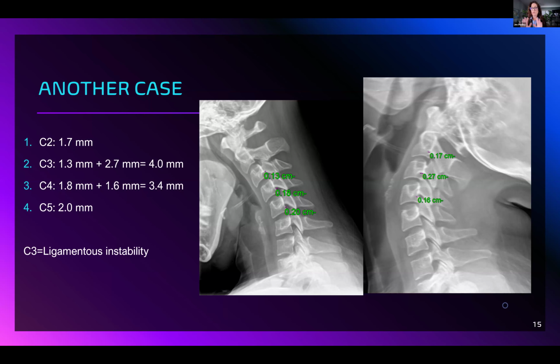They will measure this and tell me if this is extension, posterior orientation of the occiput, extension of the upper cervical spine, or lack of motion of particularly C1. There are a lot of technique-specific individuals out there, which is awesome. Also, we have to be careful because they are in lateral flexion, which will sometimes mimic the appearance that the occiput is actually contacting C1, but it's still close though. I absolutely agree with you that it's approximating and that's not typical.